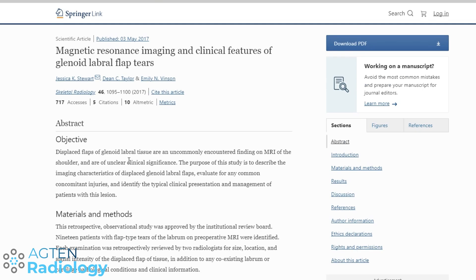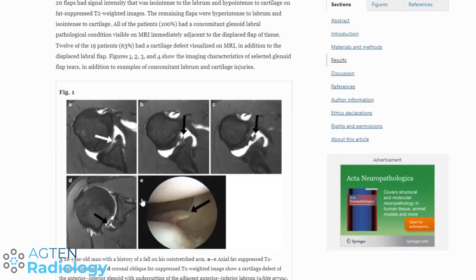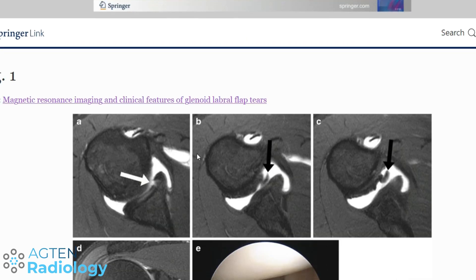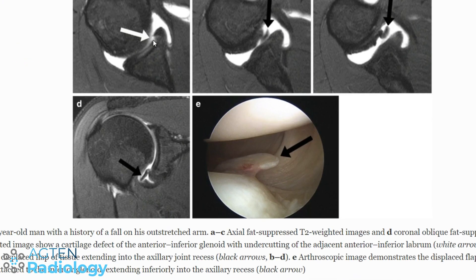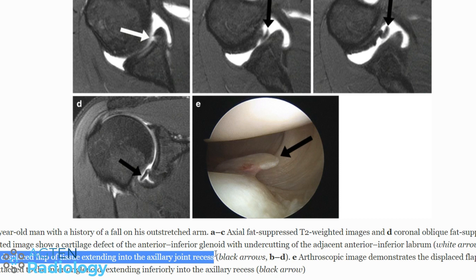This article included 19 patients with flap-type tears. Looking at the images, this is a very similar case to the one I showed — same chondrolabral tear, cartilage also affected, the flap going in the same direction. It's not a loose body or bony structure. This is basically the same case: a fall on the arm, not even a dislocation, just a delamination or shearing injury leading to a displaced flap of tissue extending into the axillary joint recess. The arthroscopic image confirms this displaced flap, still attached to the inferior labrum and going down into the recess.